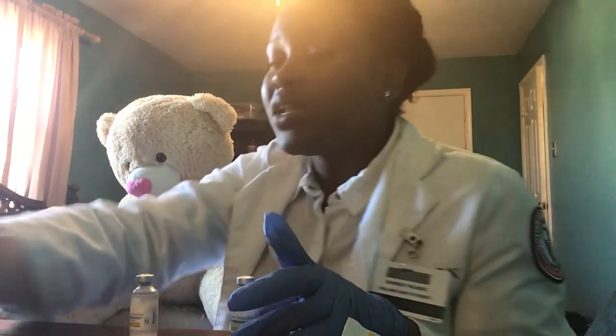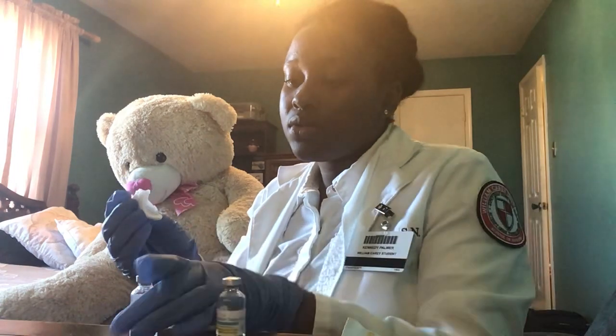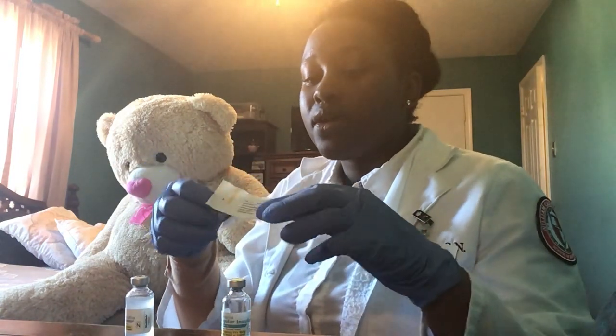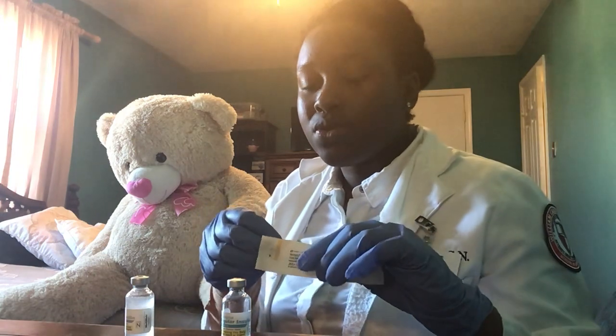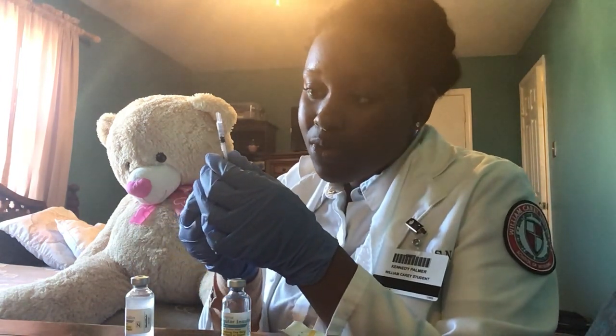Okay, and I have a clean alcohol swab here. I'm just going to clean the vials. Okay, and I have my insulin syringe here. So the order is 16 units of NPH and 6 units of regular. So I'm going to draw up 22 units of air first.